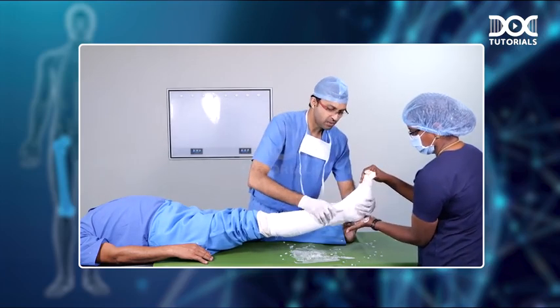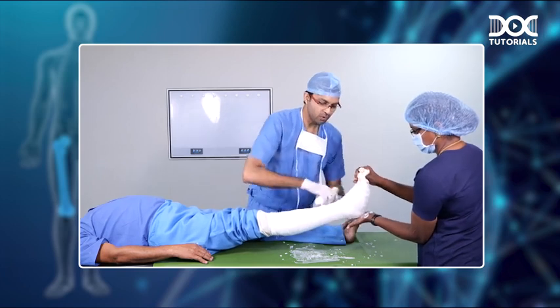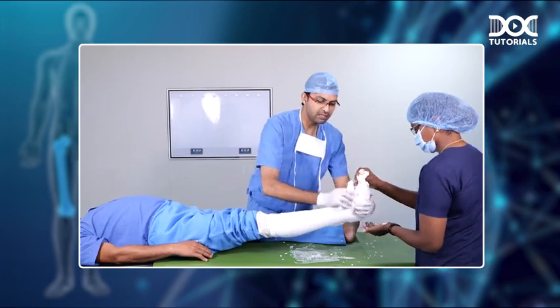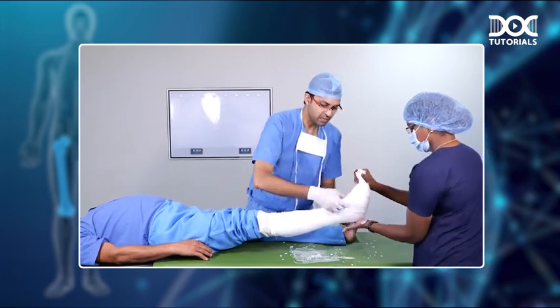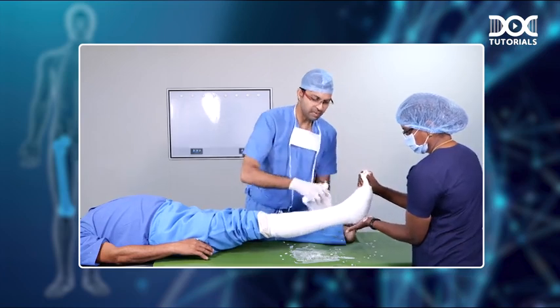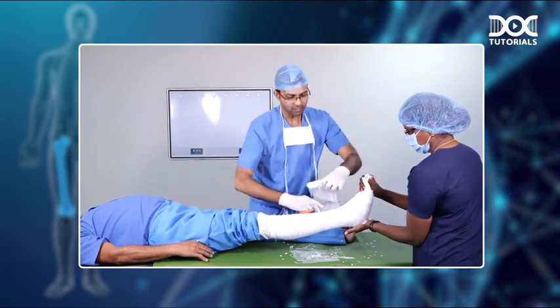Make sure that when you are doing this, the ankle of the patient should be in dorsiflexion. You do not want the leg to be in equinus, because if there is equinus, there is a risk of Achilles tendon contracture. So once you have wrapped 1 or 2 layers around the leg with the bandage, you can cut the bandage. And next step is what is important.